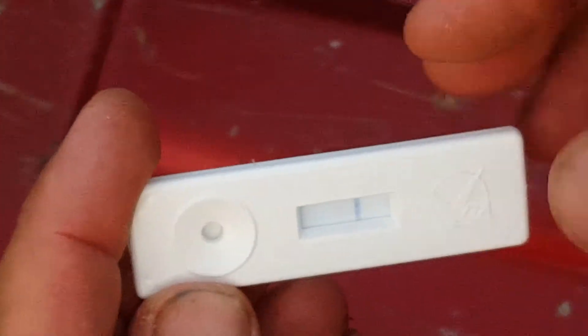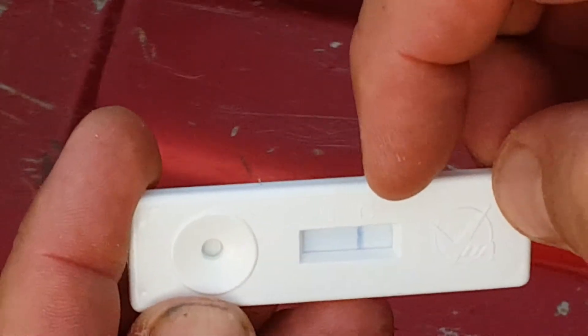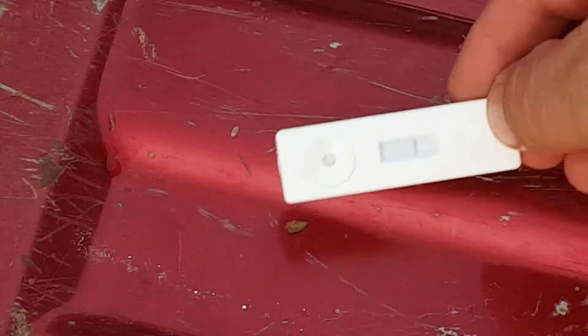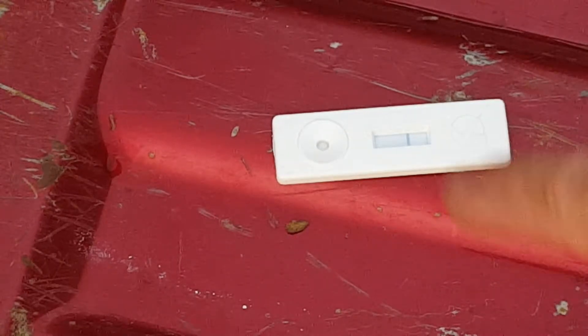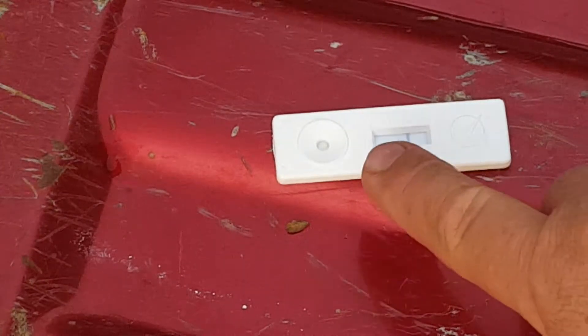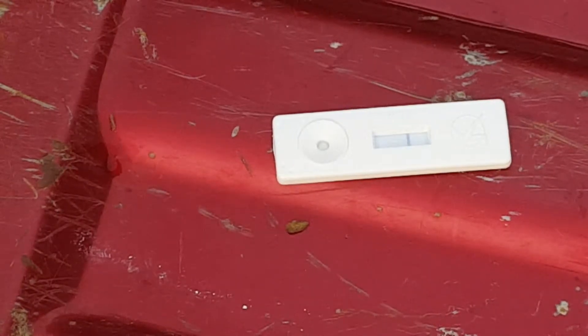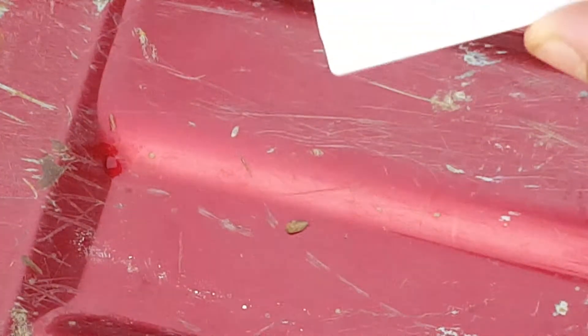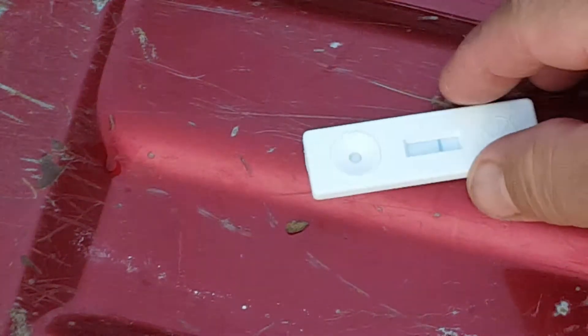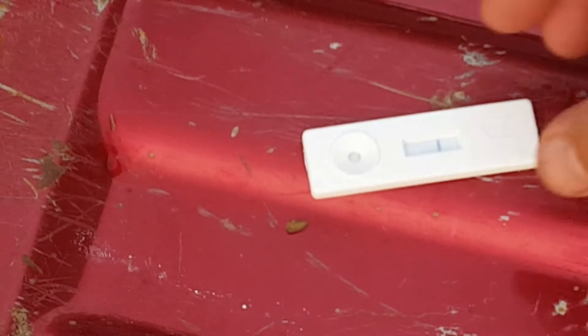So you have your test line here, then you have a control line — there's a T and a C. The C will always show up. You want the control line to show up — that shows the test is still good. The test line is what matters: if it shows up, then you're positive for either European fowl brood, or if you're using an American fowl brood test kit — which is identical to this one, it just says AFB on the back instead of EFB — any kind of line means you are positive.